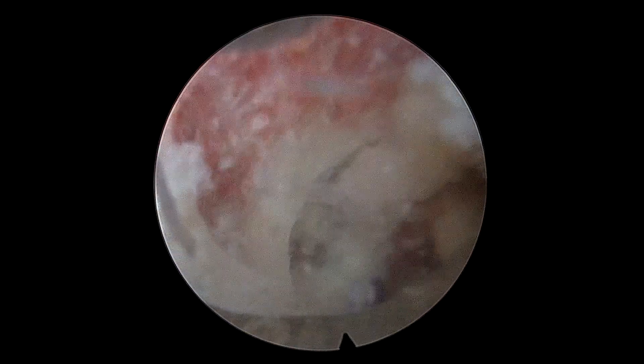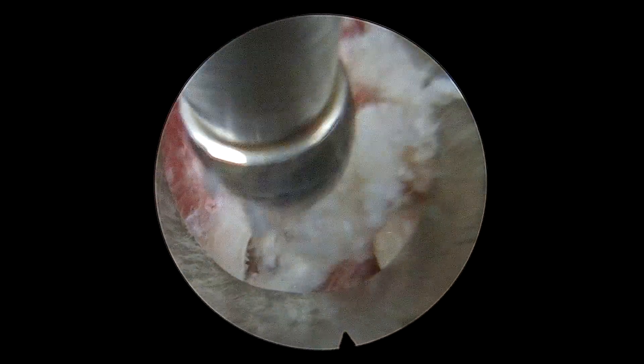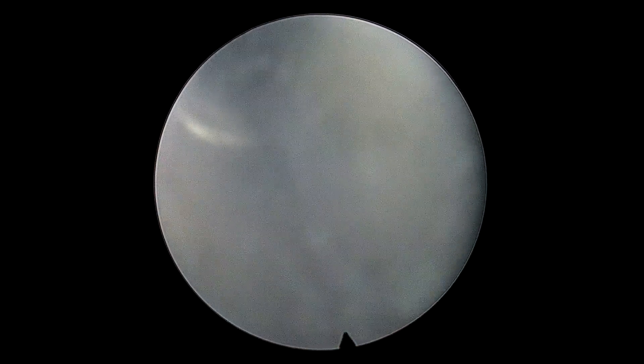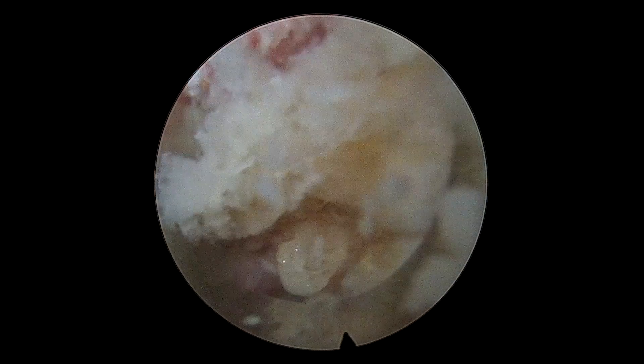The idea was to increase the space here and enter the foramen to look for any further fragments. As you can appreciate, the drilling has to be quite careful because the root is just under the drill.